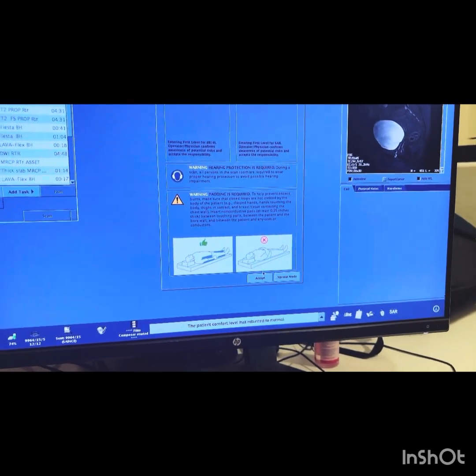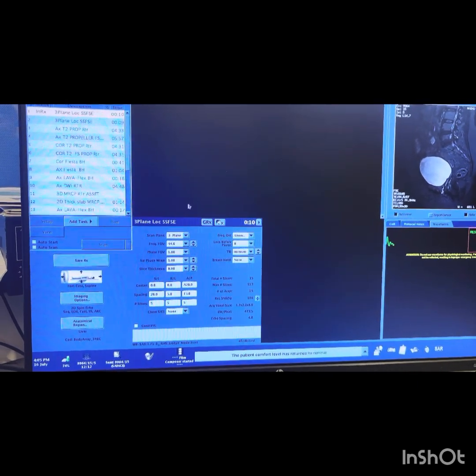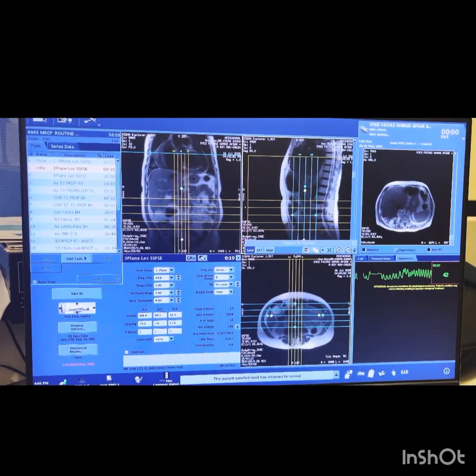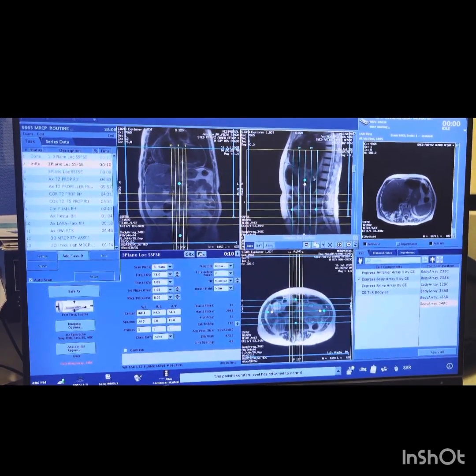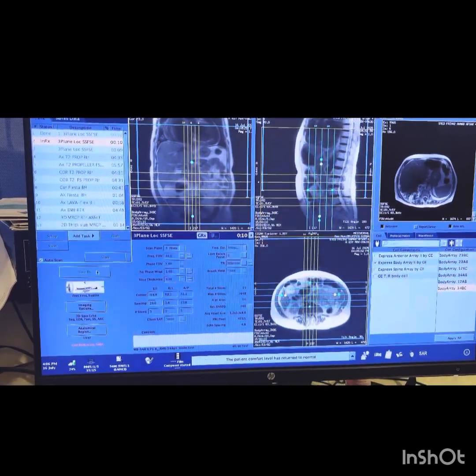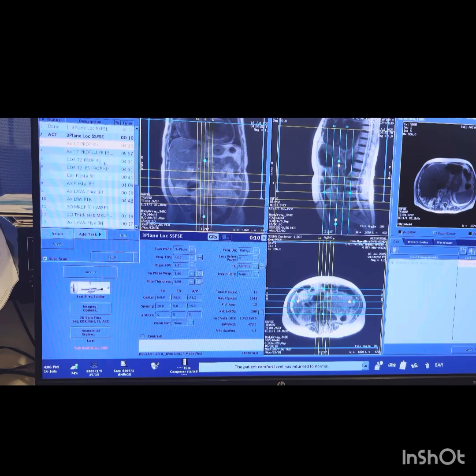Now first of all we have to indicate the waveform, and turn on respiratory gating, and then we'll take the examinations. First we'll take the 3-plane localizers, and go for setup and save. When the 3-plane localizers arrive, we'll make the planning. In that we'll see all the routine sequences in the MRCP which you are using.